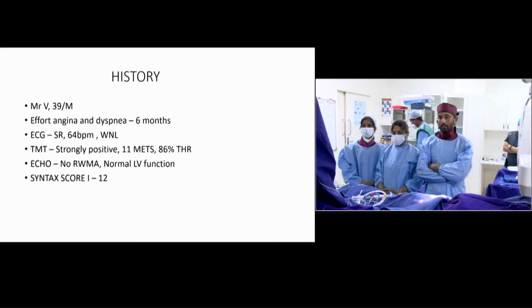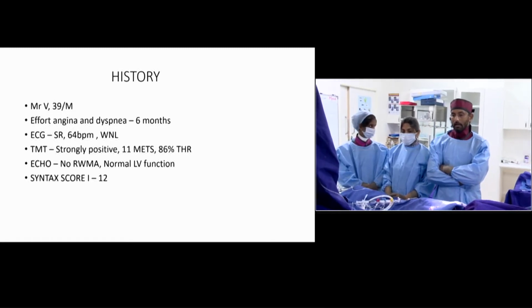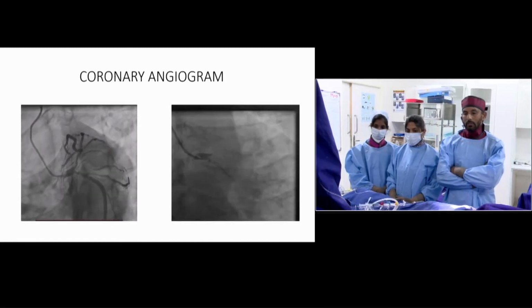So he underwent a treadmill test. The treadmill was strongly positive for inducible ischemia, and therefore he underwent coronary angiography in the local hospital. So this is the first.